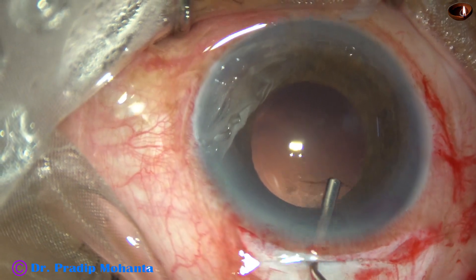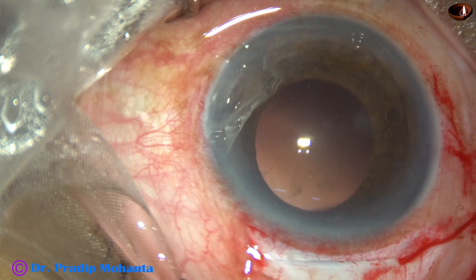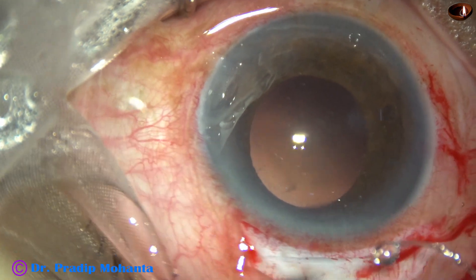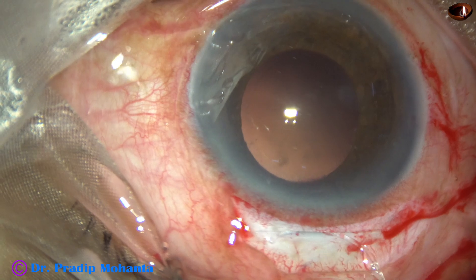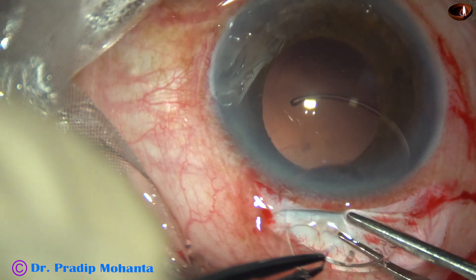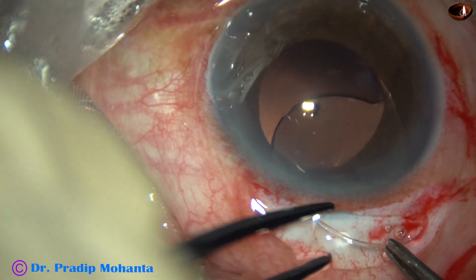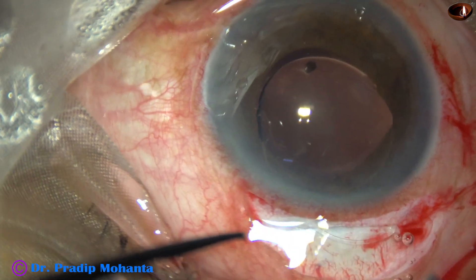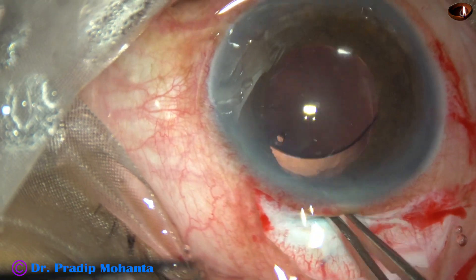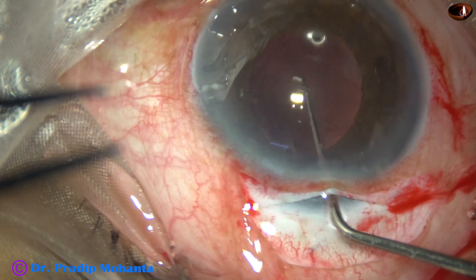The capsular bag and anterior chamber is filled with two percent HPMC viscoelastic. A PMMA — polymethyl methacrylate — intraocular lens with a six millimeter optic is being implanted in the capsular bag. The leading haptic goes into the capsular bag, and then the trailing haptic goes in, and the lens becomes nicely centered.